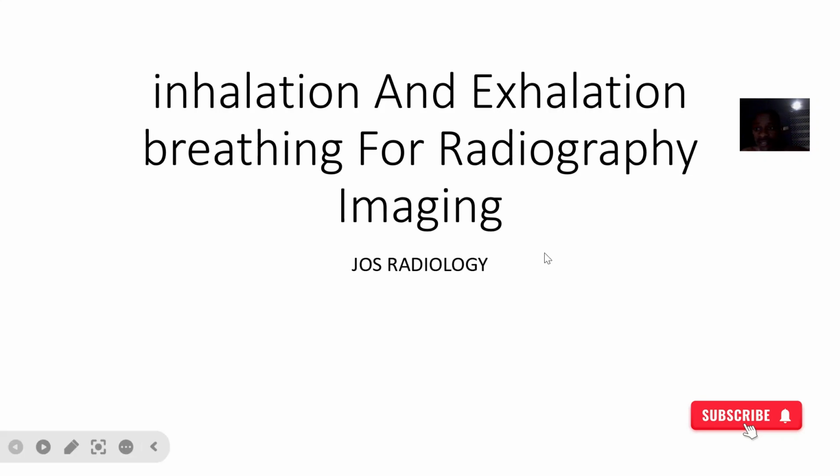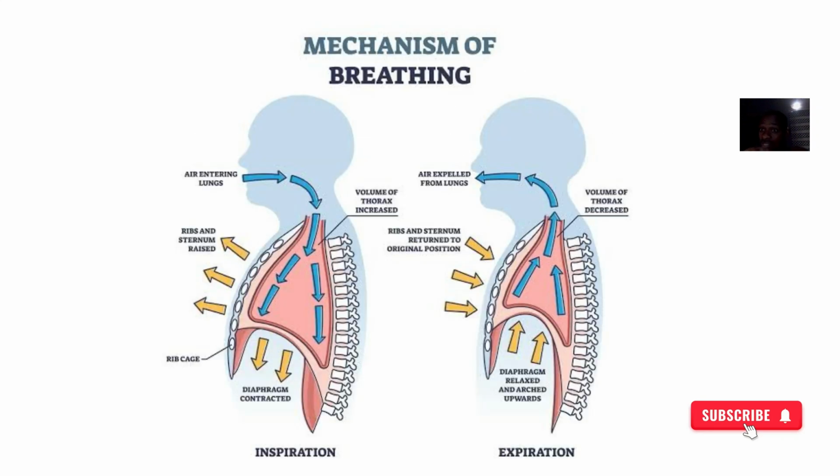Now we'll look at another part of the procedure. Sometimes when they want to image you, they might ask you to breathe in and breathe out. So I'll look at the two of them and the various reasons why they might ask you to breathe in or breathe out before they actually take an x-ray.